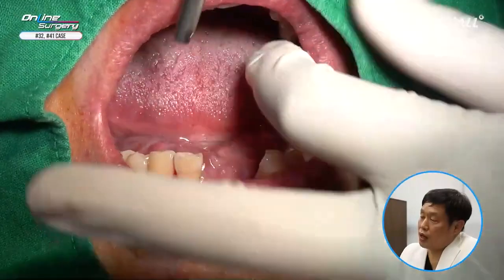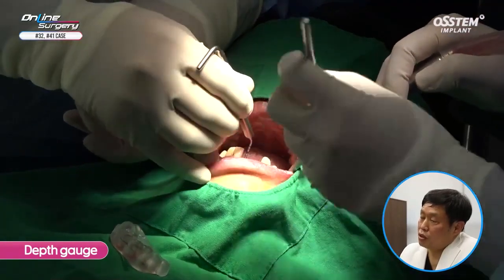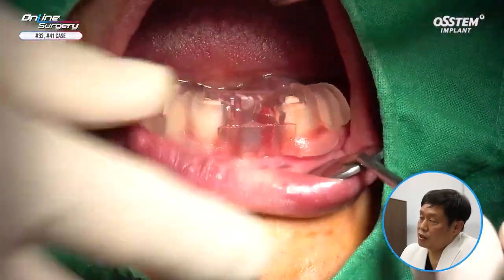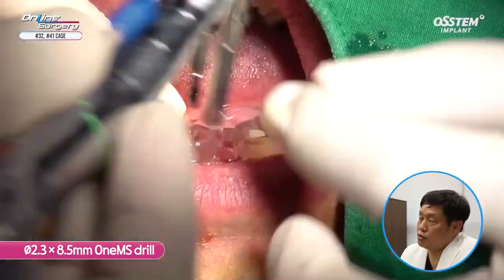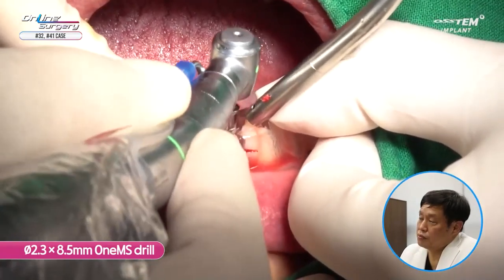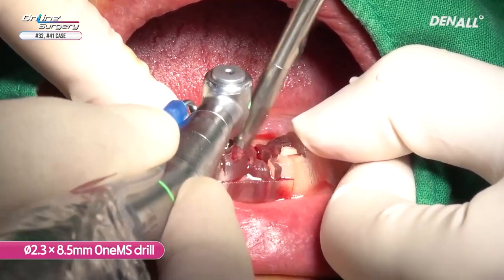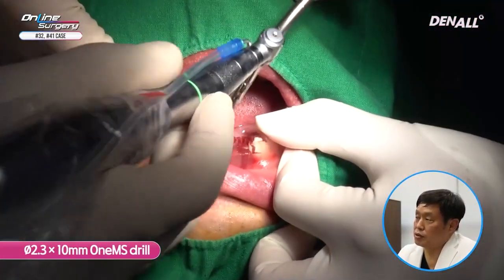The bone was not very hard. In the case of the lower, it can slip, so I am going to remove the template and use a depth gauge to check whether slipping has occurred. I checked once again — no deviation and no perforation. I am positioning the template once again. 2.3x8.5 drilling is being done for double contact. For number 32 and 41, full length drilling is done. Then the 2.3x10 mm drill is used.